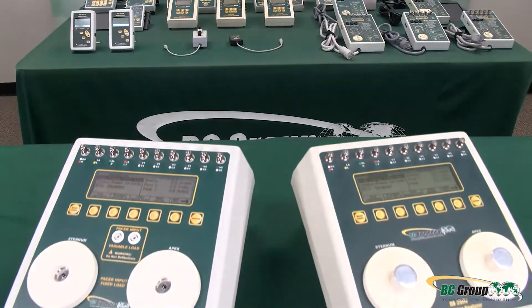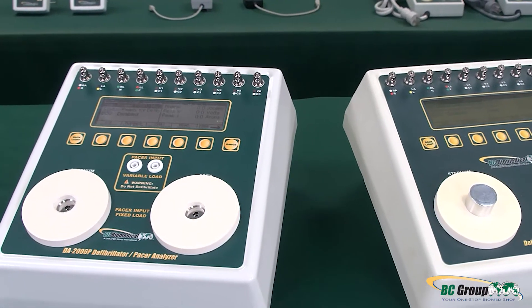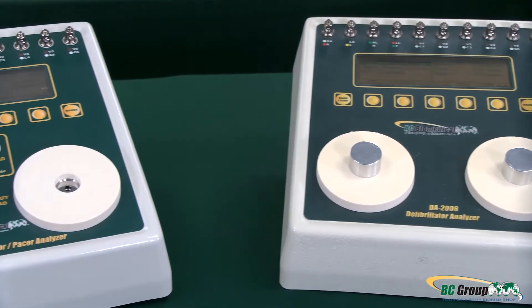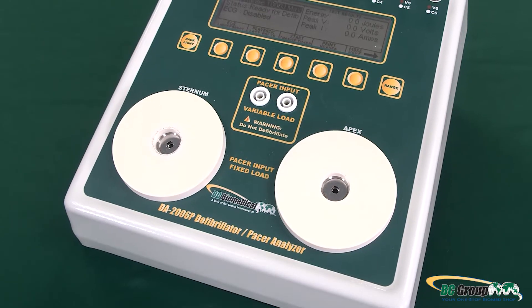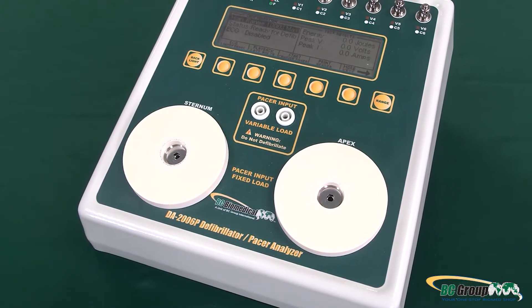The DA-2006 and the DA-2006P can test monophasic, biphasic, and pulsed biphasic waveforms, and both can also test AEDs. Our DA-2006P model has the added capability to perform transcutaneous pacer testing.